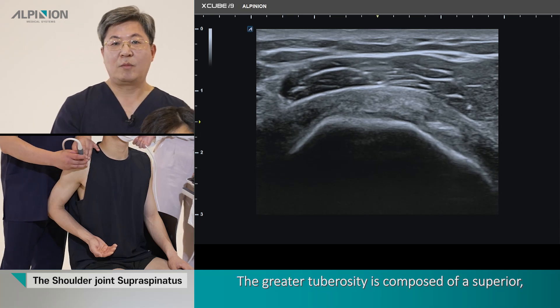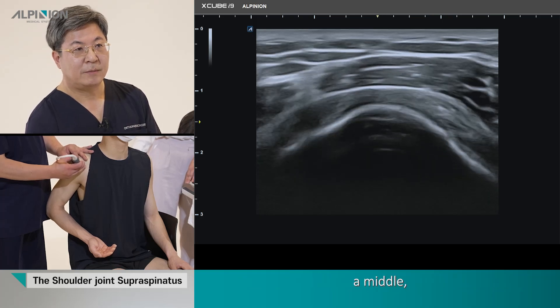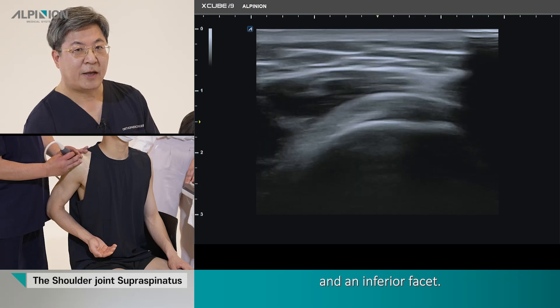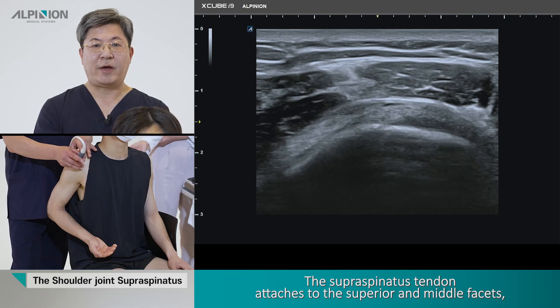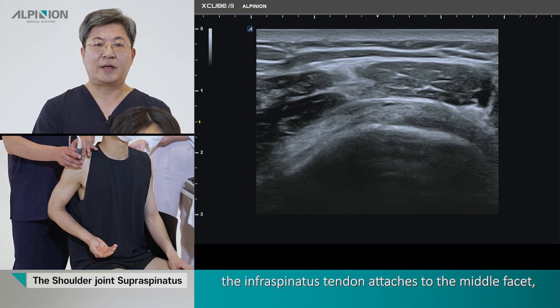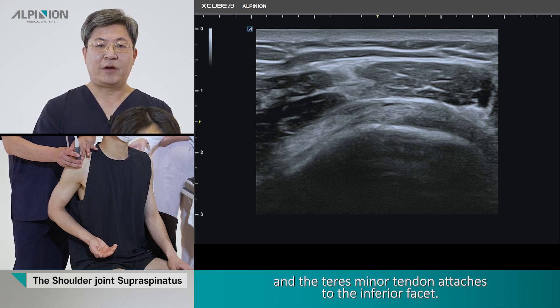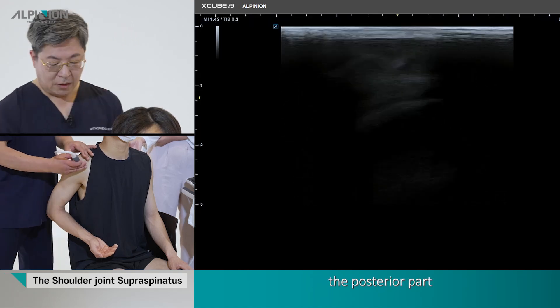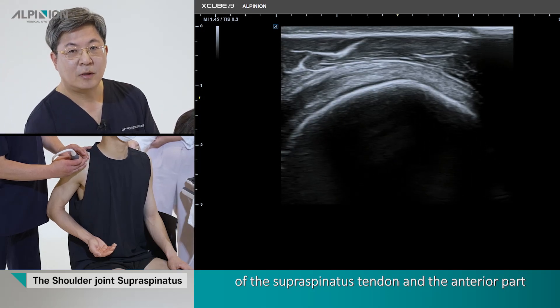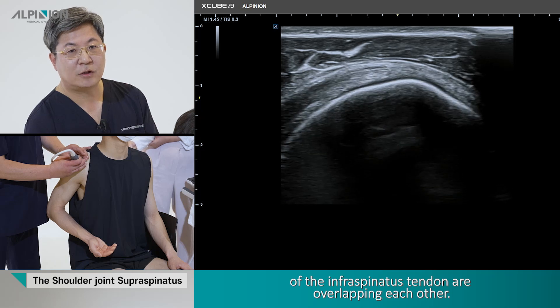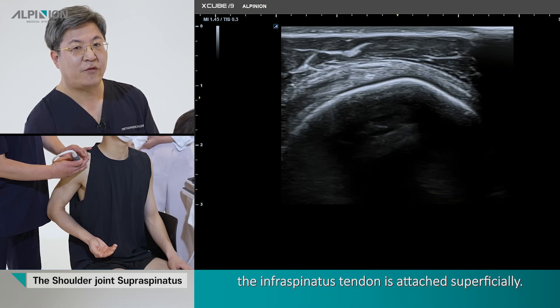The great tuberosity is composed of the superior facet, middle facet, and inferior facet. The supraspinalis tendon attaches to the superior and middle facet, the infraspinous tendon attaches to the middle facet, and the teres minor tendon attaches to the inferior facet. Among these, the posterior part of the supraspinous tendon and the anterior part of the infraspinous tendon overlap each other, with the supraspinous tendon deep and the infraspinous tendon superficial.